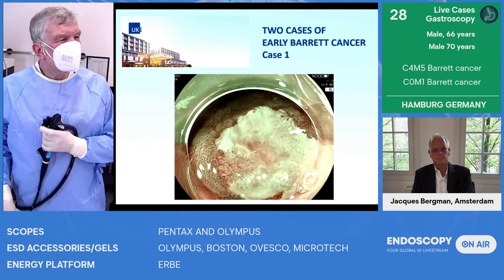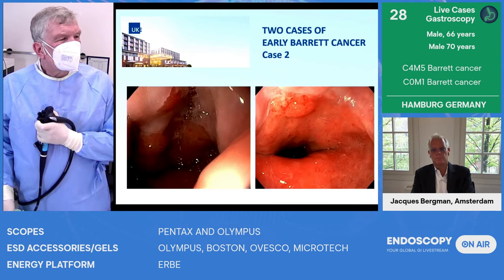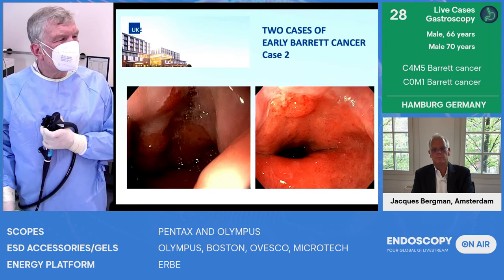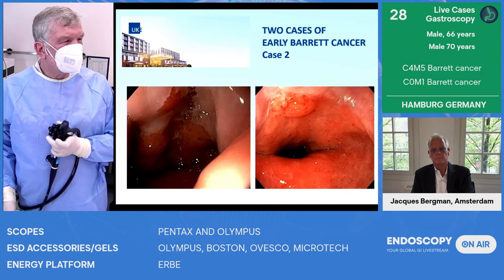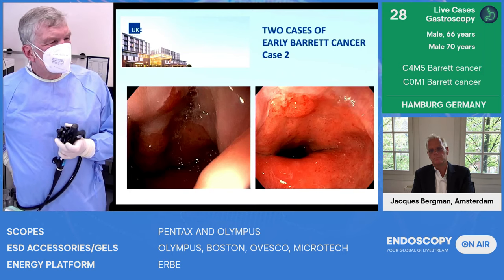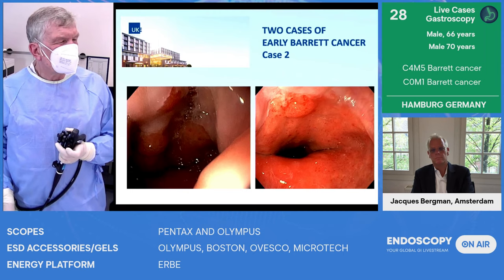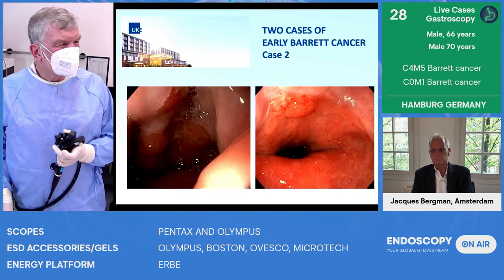Case number two, which is my case, next slide, is simpler, but a little bit hidden in a hernia. It looks like a cardiac cancer, but histology says it's Barrett's. If you look at the left side, if you are in a quick mood, you might miss it and say, oh, there's some inflammatory tissue. And if you take a closer look, it looks more suspicious.